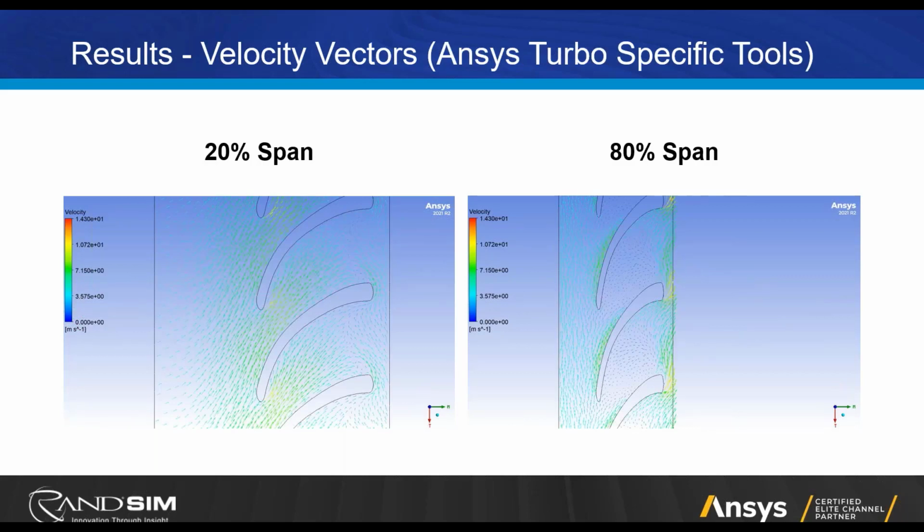Okay, so if you remember in BladeGen, I mentioned that blade-to-blade view. Well, in the post-processor, we also have a similar view that you can construct, which makes it a lot easier to see what's happening in the flow passage. You can't see real well here, but the vectors, the first thing you want to look at is how well they line up with the tip of the blade. And you can see in this case, there's a little bit of mismatch or incidence between the blade and the flow, and that's generally not good. Yes, right there, thank you.